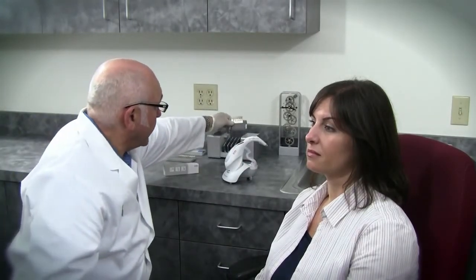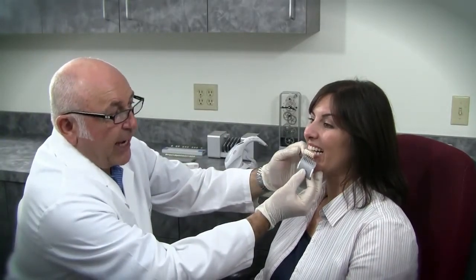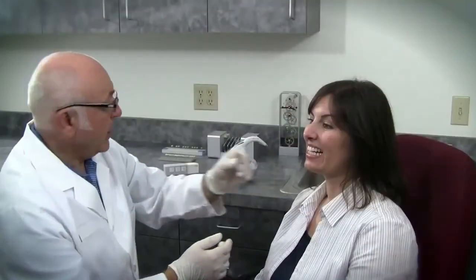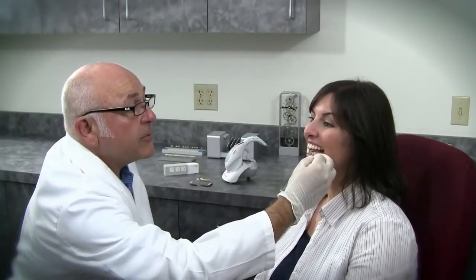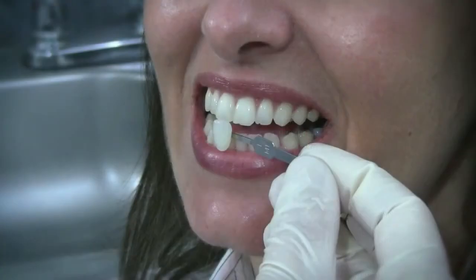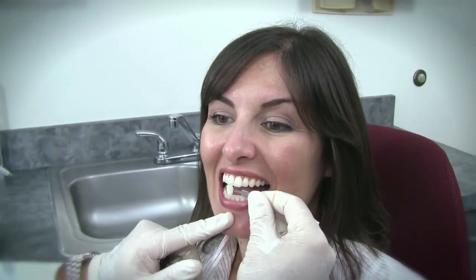I'm going to be using the 3D Master Shade Guide. In this method, we select the appropriate brightness of the patient and we can see instantly that she's in the one group. I reach for the actual guide itself and pull out 1M1. If you could open your mouth a little bit for me — I think that looks really a nice match.